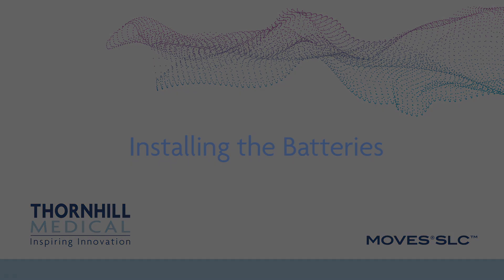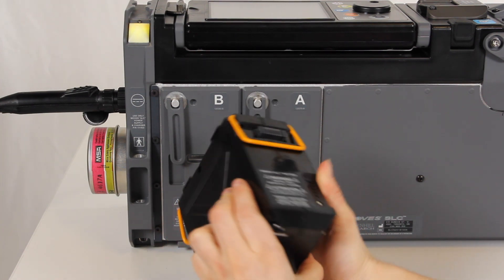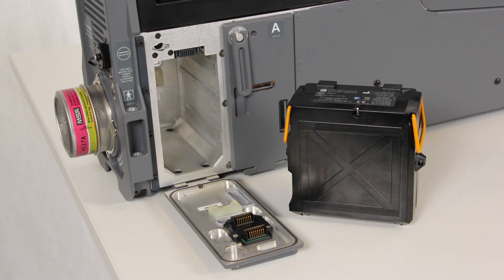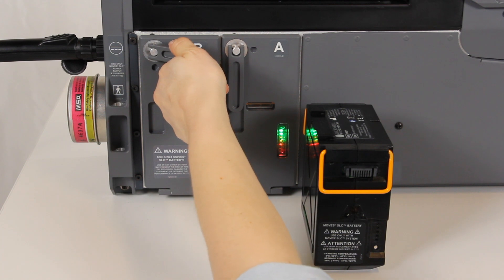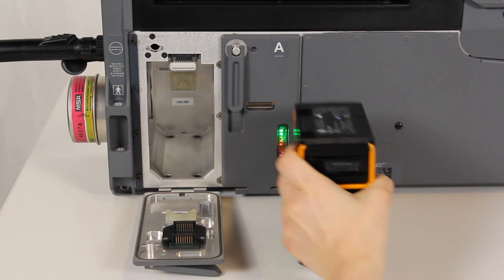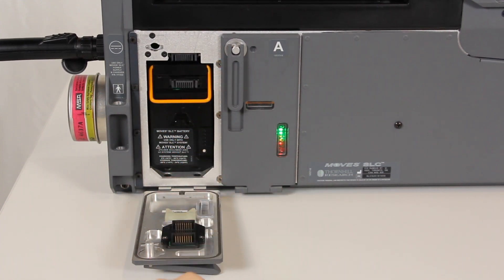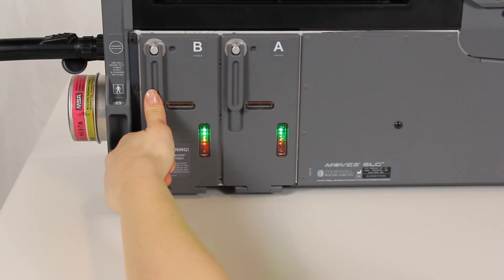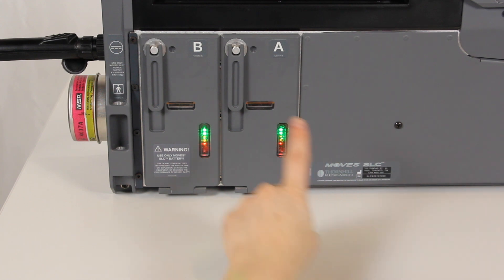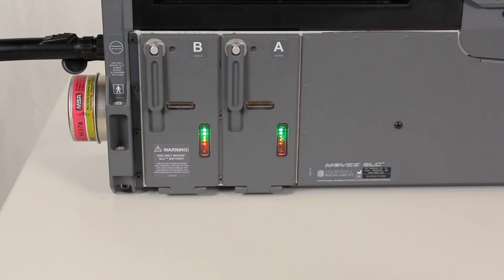Installing the batteries. Inspect the battery for physical damage such as cracks, holes, and leaks. Do not use or charge a damaged battery. Lift the battery compartment latch and turn it 90 degrees counterclockwise to open the battery bay door. Push the battery into the battery compartment until it engages, ensuring the battery is fully inserted and properly seated. Close the battery bay door and rotate the latch 90 degrees clockwise, then lock it by pushing the latch in. Repeat this procedure for the second battery. If a battery requires a charge, it can be recharged simultaneously during normal operation when the MOVES SLC is connected to the power supply.